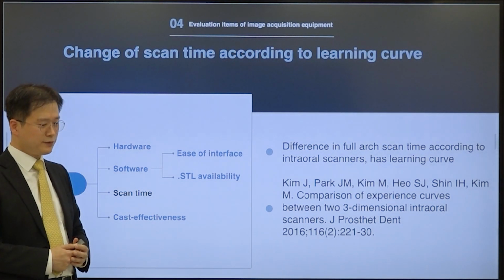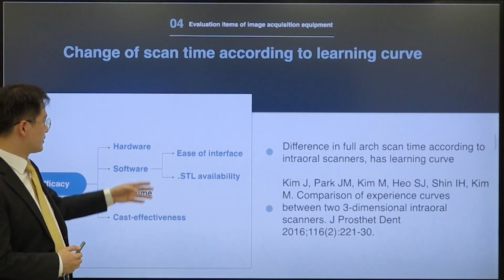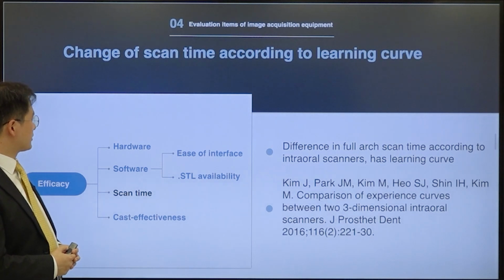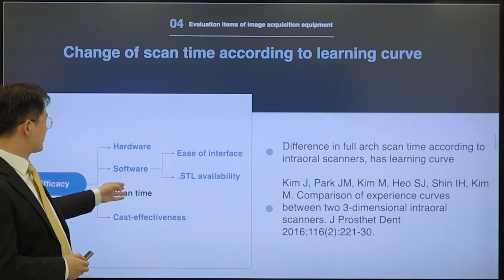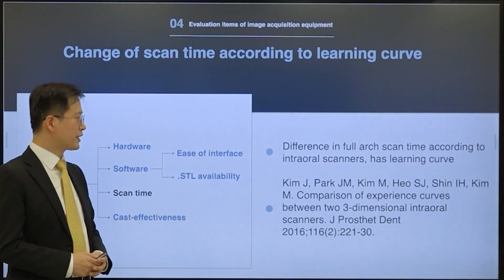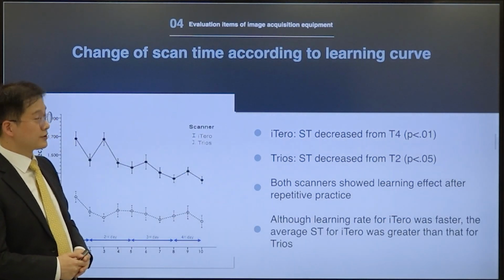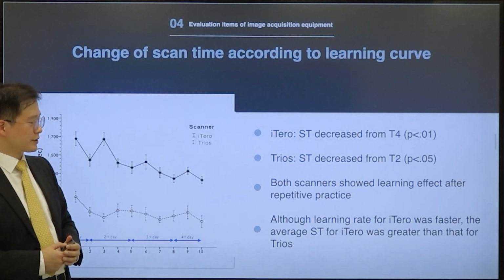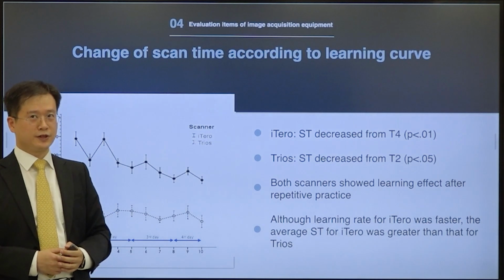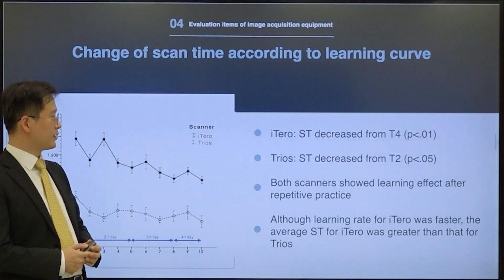Also, regarding the efficacy, I will explain about the hardware and software of intraoral scanners. And regarding the scan time, we have to think about a learning curve, because these intraoral scanners are digital devices and we have to learn how to operate effectively.